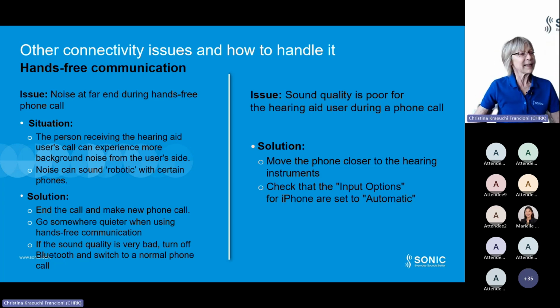Okay, so one issue which has been reported was about hands-free communication, which means noise at the far end during hands-free phone calls. So there is no good sound when the client does a hands-free phone call. The person receiving the call can experience more background noise, or the noise can sound robotic with certain phones.